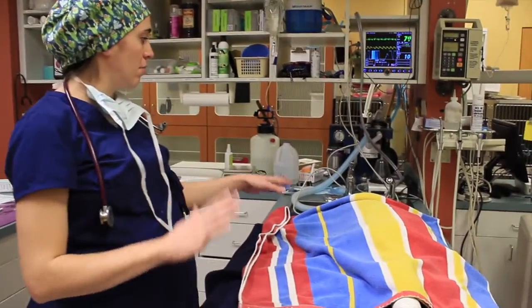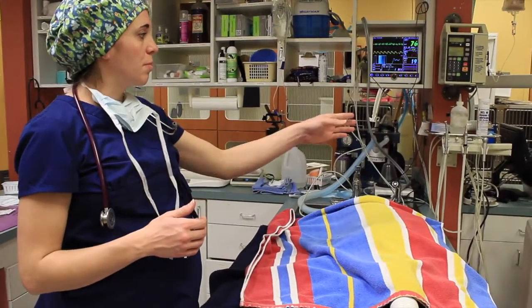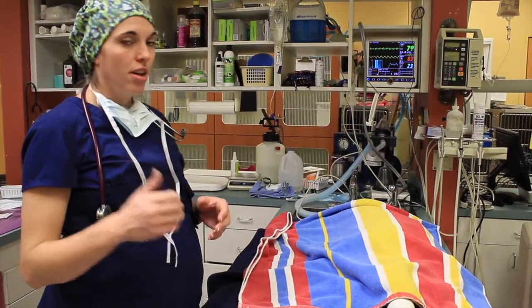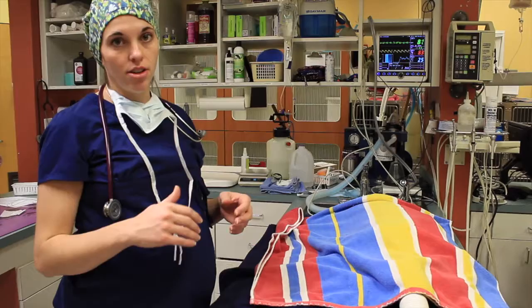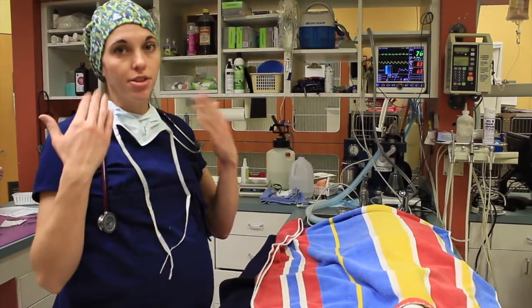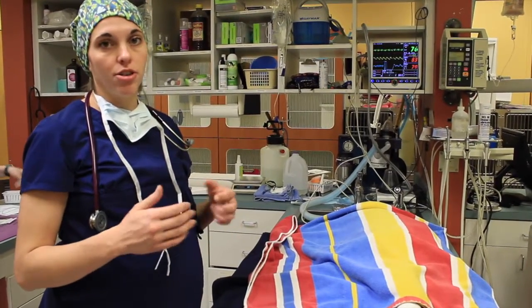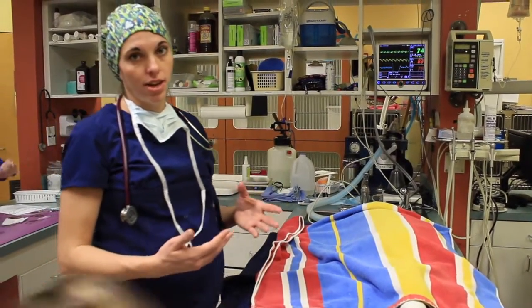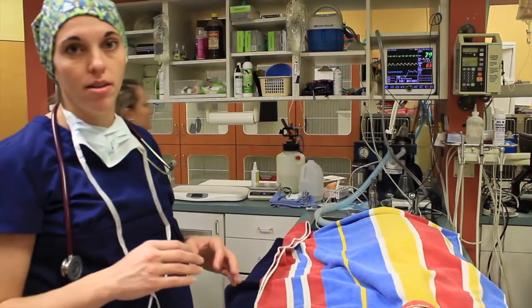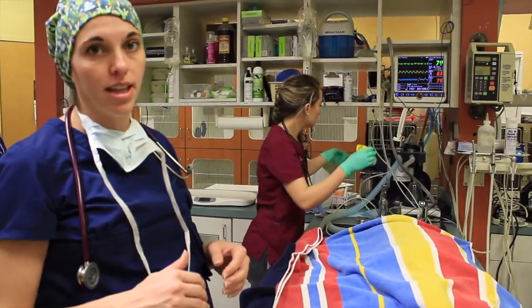Once she's hooked up to all the monitoring equipment and doing well under anesthesia, the next step is to take some x-rays. Brenna is getting that set up right now. We take x-rays of all the teeth so that we can see the tooth roots. Sometimes there are problems under the gum line that we can't see just during an exam, so doing complete dental x-rays helps ensure a more thorough dental cleaning and that there are no problems hiding beneath the surface.